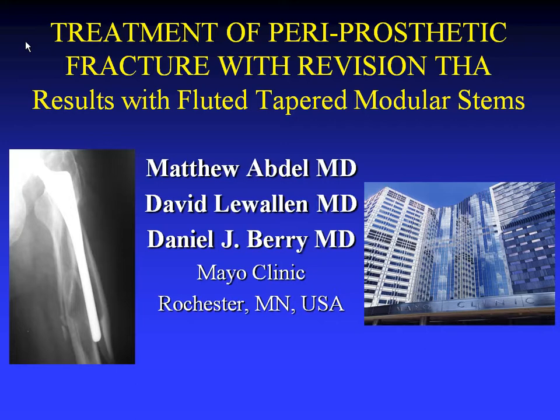Then I'm going to speak specifically about one technique that we've been using of attacking the so-called Vancouver type B2 and B3 fractures. Those are fractures associated with a loose implant. Rather than give a long overview of the topic, I'll invite any of you that want to hear an overview of the topic to come to the International Hip Society meeting tomorrow, where I have a longer talk on the topic. So with that background, I will talk about treatment of periprosthetic fractures with revision hip arthroplasties, and we'll talk about the results of using a specific category, not brand, of stem.